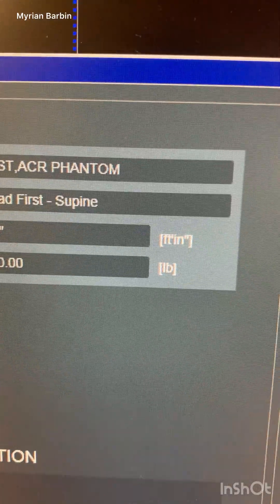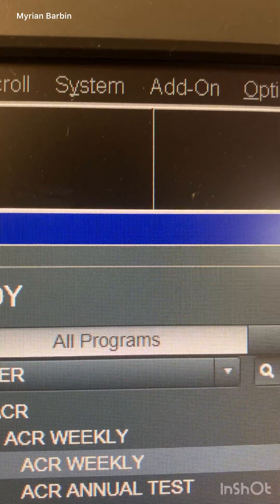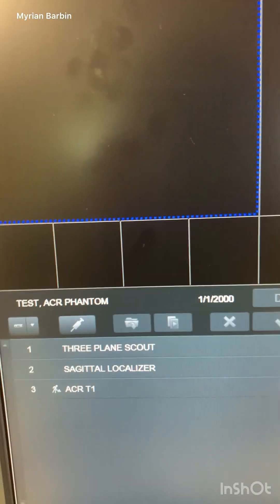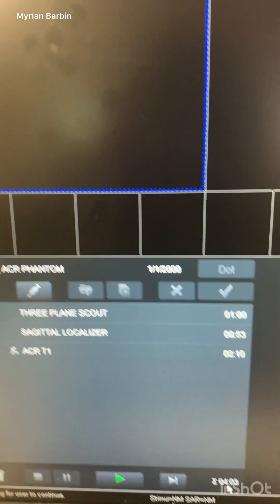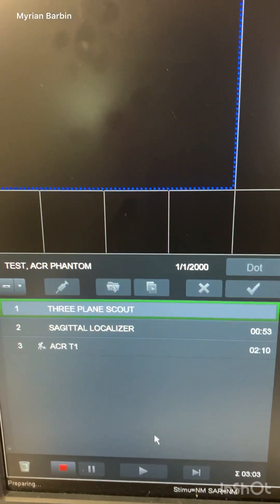This video is about how to perform an ACR weekly phantom test for an MRI machine. This is a Siemens machine — you can see the phantom name right here. The whole process takes about four minutes, and we're going to start with the three-plane scout.